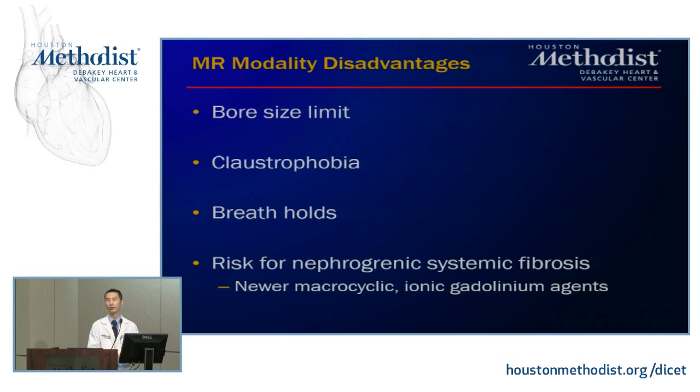Again, the patients ideally should be able to do breath holds. If they can't do breath holds, then the images are going to go all over the place and reduce our image quality. So unfortunately, patients who are huffing and puffing, like decompensated heart failure patients, are probably not the best patients to be sending down for a cardiac MRI in general.